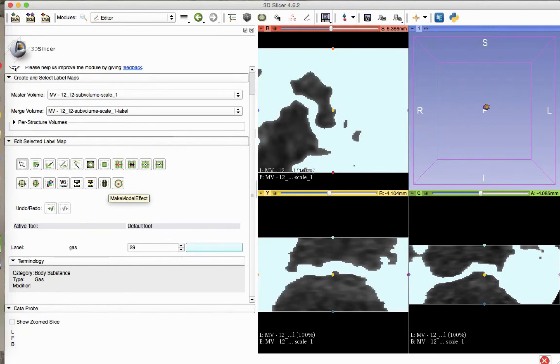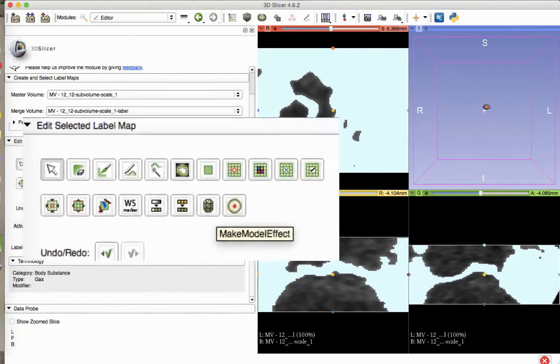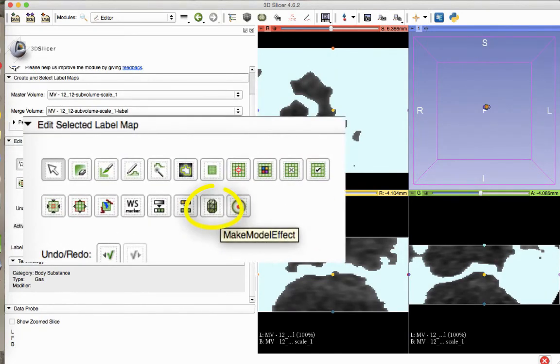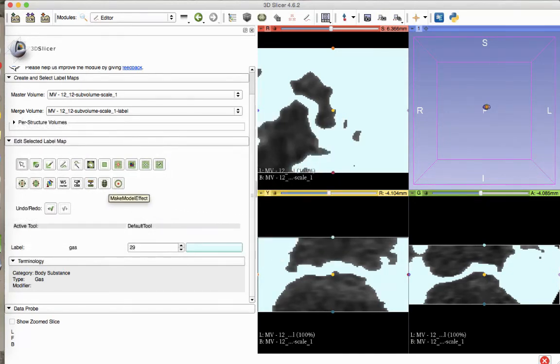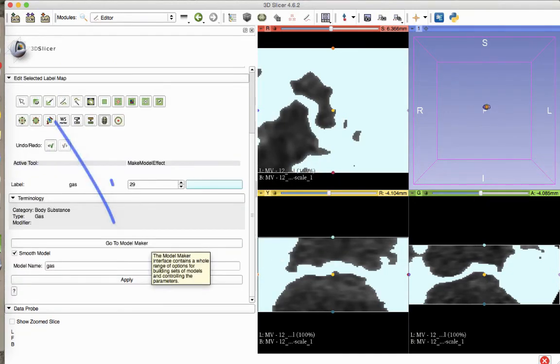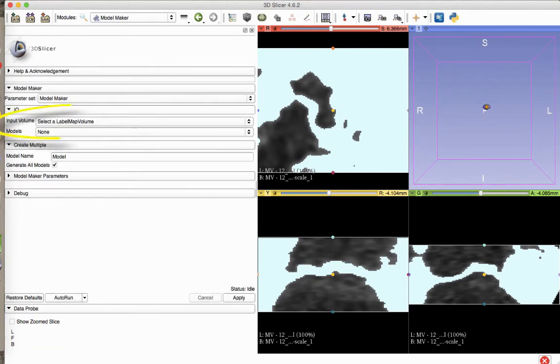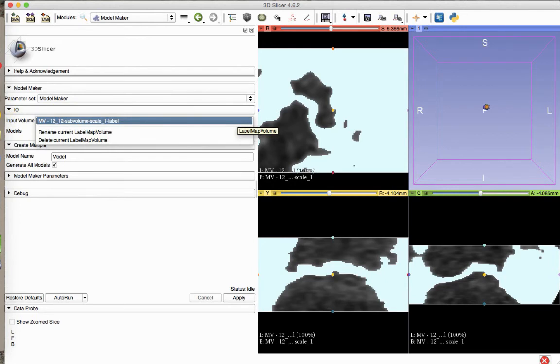Now select the Make Model Effect button under the Edit Selected Label Map heading. After selecting the Make Model Effect button, select Go to Model Maker. This will take you to the Model Maker module. Under the Input Volume drop-down menu, select a volume called Subvolume Scale Underscore 1-Label.